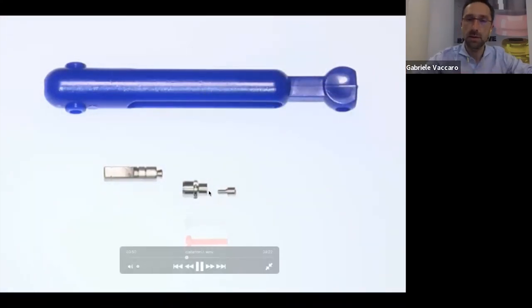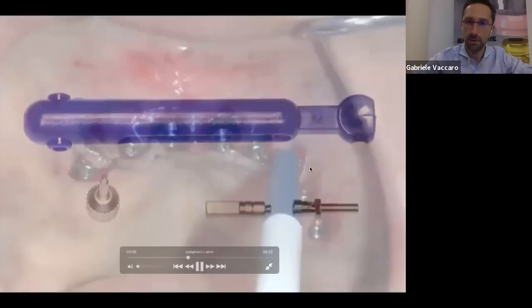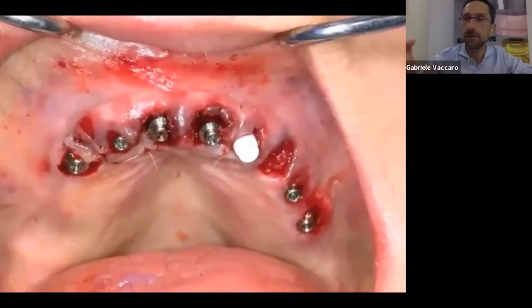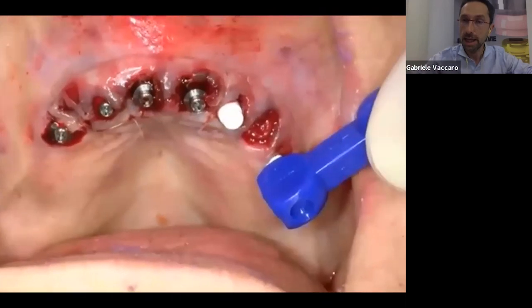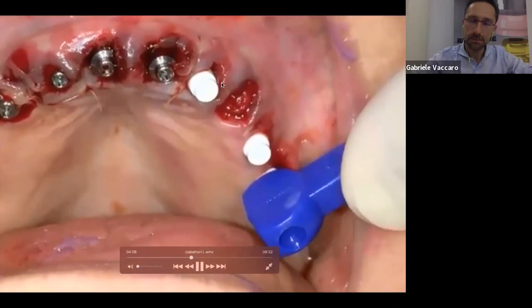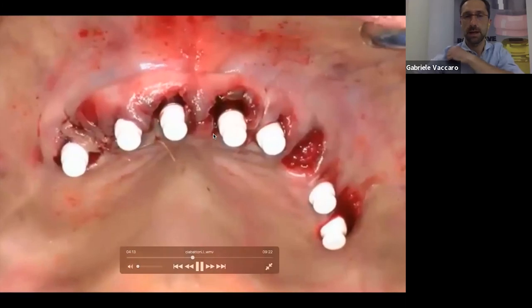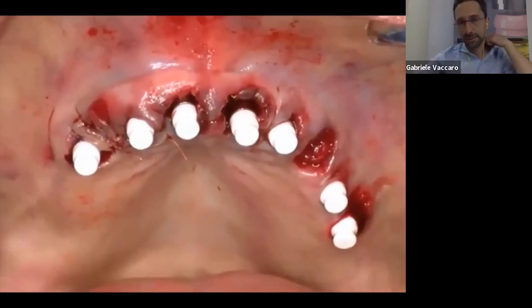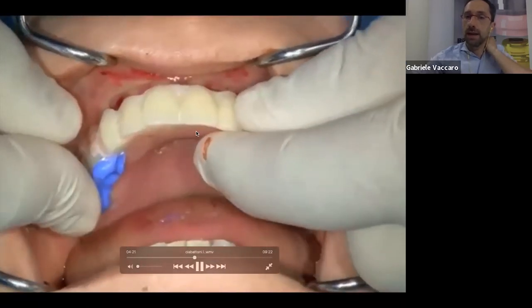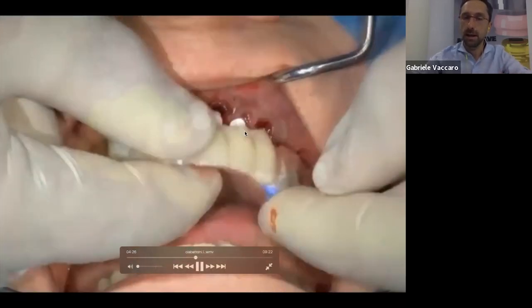And then you put the transfer, mini plastic transfer. These are the transfer. Mini plastic transfer. They are very low profile transfer because they have to fit inside the impression tray that we saw before. So clip all the plastic transfer and then check that your impression tray doesn't interfere with any of that. You see that there is some contact here and some contact here of the impression tray.